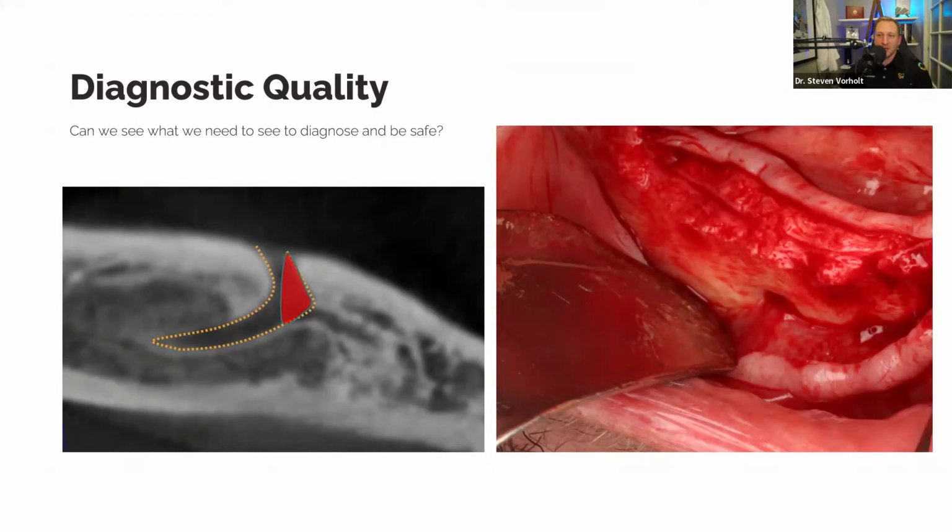We have things like here, what we're looking at is the anterior loop of the mental foramen or the mental nerve, which sometimes is misconstrued as the offshoot. We already talked about the incisive branch, which is not the anterior loop. And one thing to consider when you're looking at the mental nerve and you're considering where to place implants is look at the luminal size of the vessel.